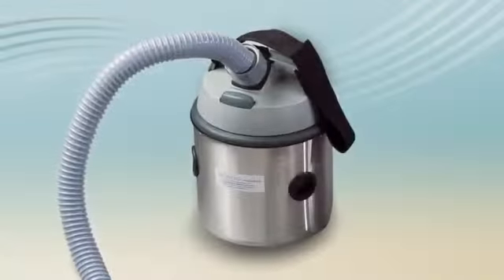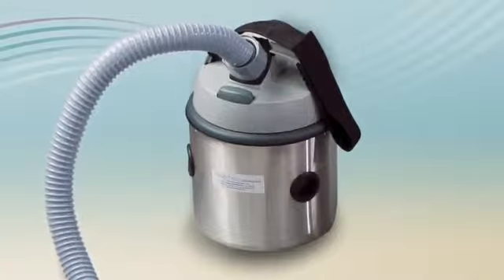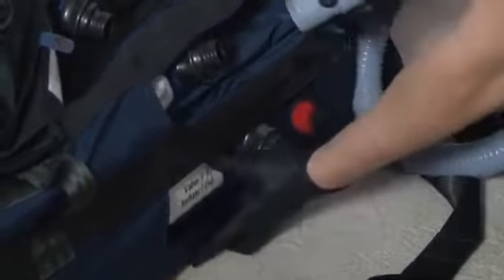To ensure that each air chamber is fully inflated, remember to look, listen, and feel. Look. Watch the chamber inflate. If the patient is on the device, you will notice the patient's body will stop rising when the chamber is fully inflated. Listen. The sound of the air supply will change to a higher pitch once the chamber is fully inflated. Feel. The chamber should feel rock hard to the touch.